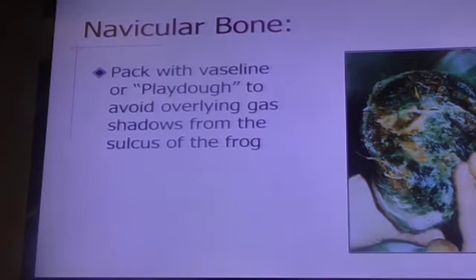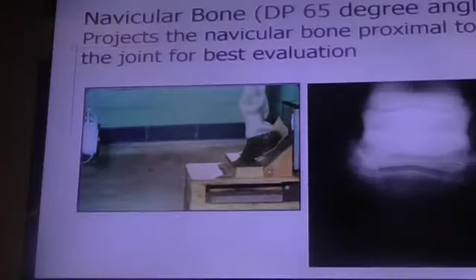Now you can use Vaseline. Vaseline is messy. Of course, you would have to put the foot in a plastic bag, or you can use Play-Doh, and that way it gets rid of the gas in the sulcus of the frog, so it won't cause misdiagnosis of the navicular bone and navicular fracture.